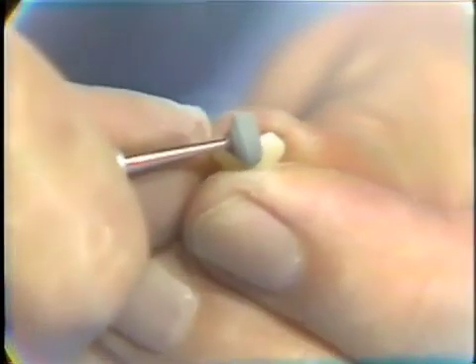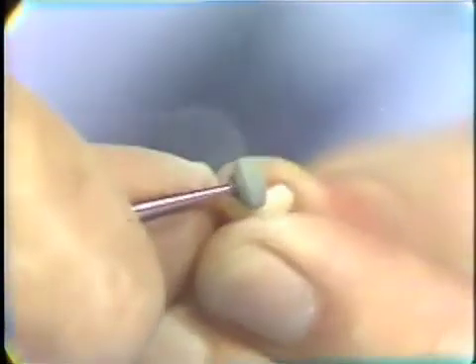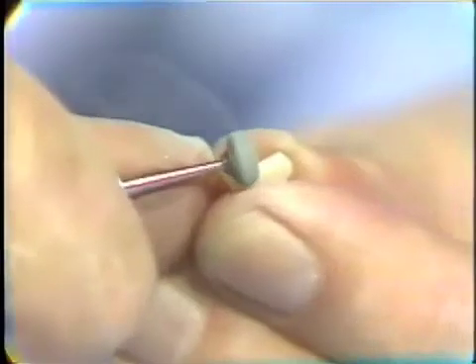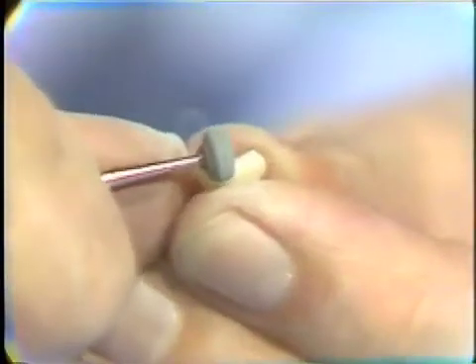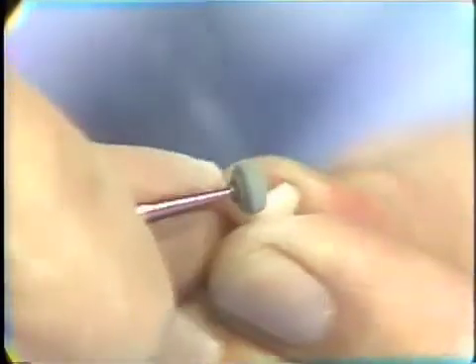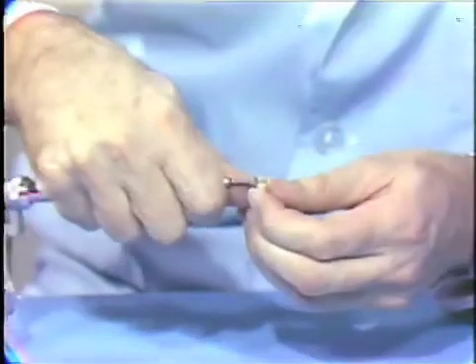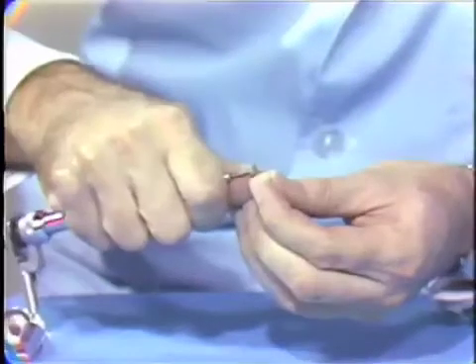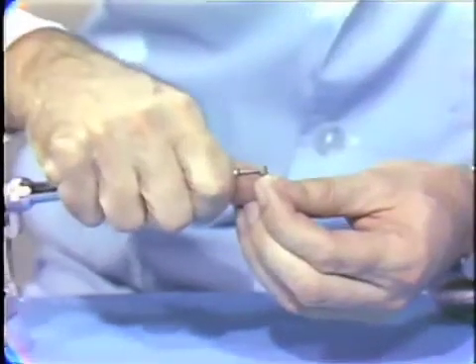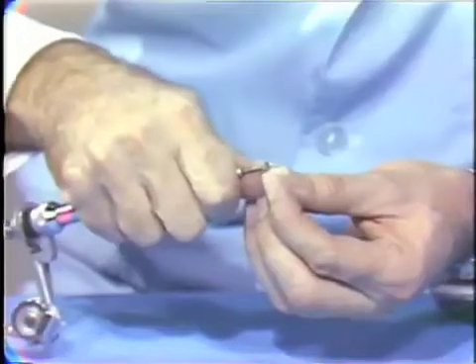And then comes around onto the mesial proximal here. Now when I've done this, I'm going to mark it in pencil so that you get a better concept of just where the bevel is. Notice it stops short about the junction of the buccal and proximal surfaces there.